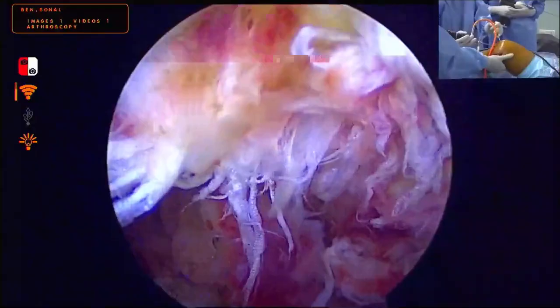Okay, load it. What is the first one? Second, please. Pro, please. Pro, please. So you can see that this is my ACL stump. Okay, it's not good, but it is not bad also. In this multi-ligament scenarios, these are all bound to heal.